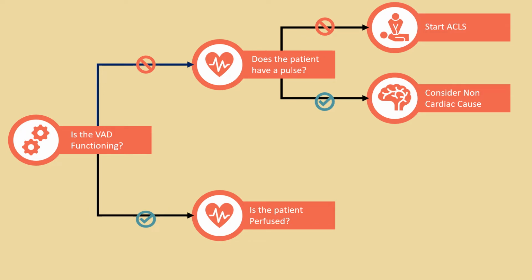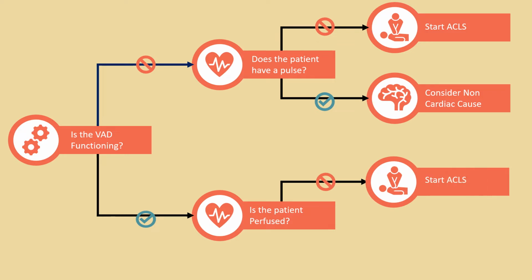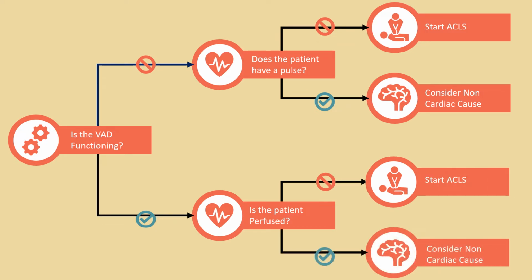Similarly, though, you're going to check if the patient's perfused. If they're not perfused, then you start ACLS. If they are perfused, then you want to look for non-cardiac causes. So let's take a deeper dive into each of these.